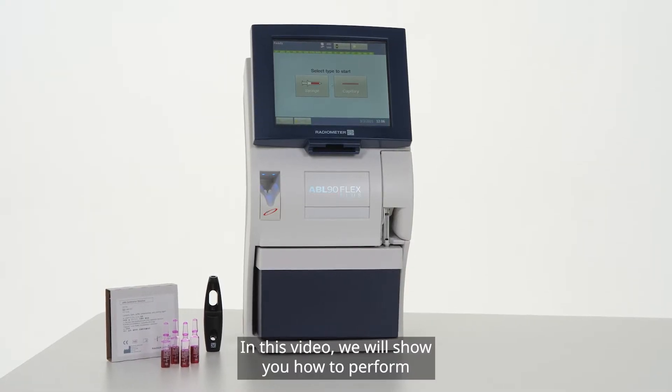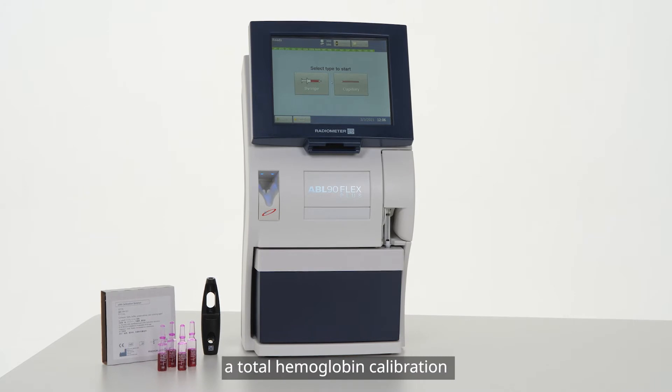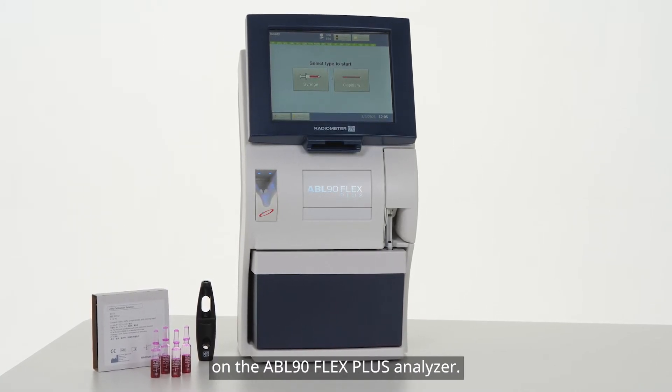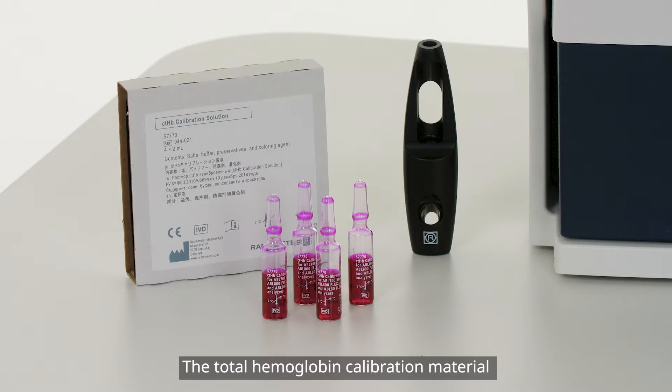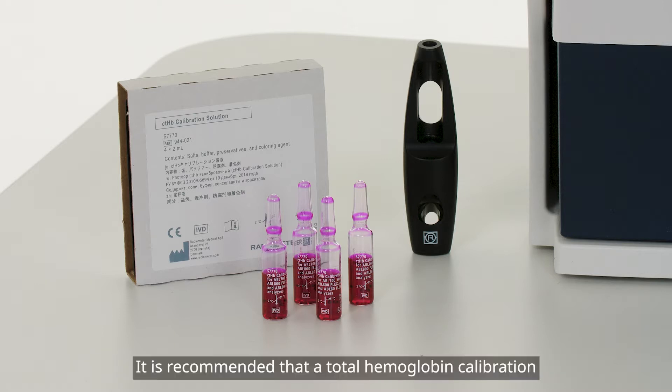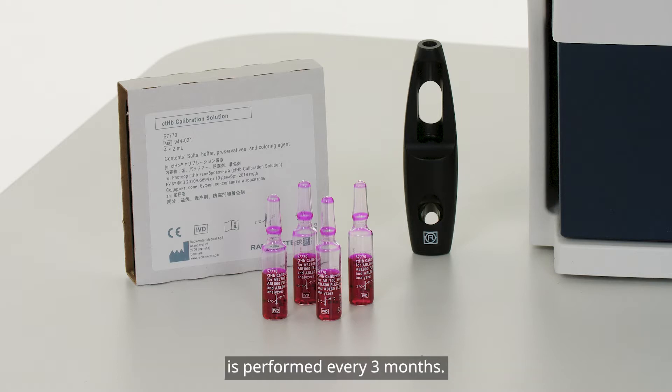In this video, we will show you how to perform a total hemoglobin calibration on the ABL90 Flex Plus analyzer. The total hemoglobin calibration material comes in a box with four ampoules and is stored at room temperature. It is recommended that a total hemoglobin calibration is performed every three months.